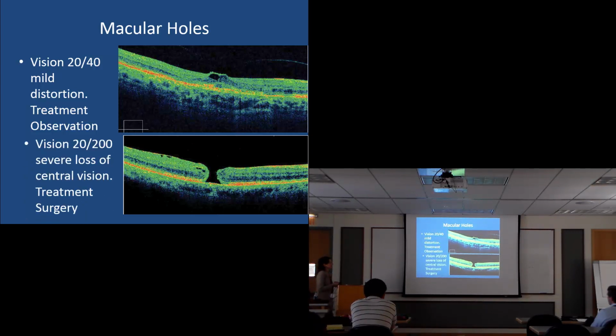on safety. However, this patient, which might look the same clinically, really has a full thickness hole. That entire neurosensory retina is separated. The reason we hypothesize is that this epiretinal membrane, which is causing these striations, is pulling on the retina, creating that gap, and it breaks there. So this is actually a common problem. We see this often. It's one of the main surgeries that people do. It can happen to anyone. We're not sure of risk factors.